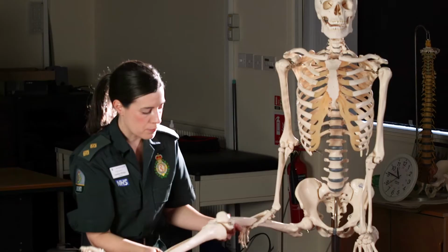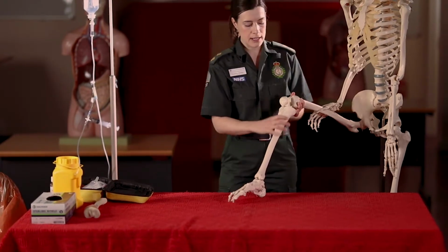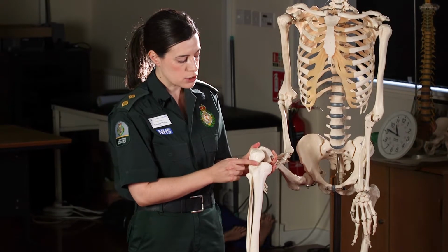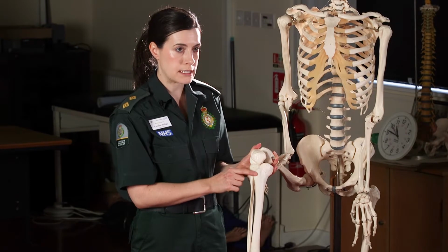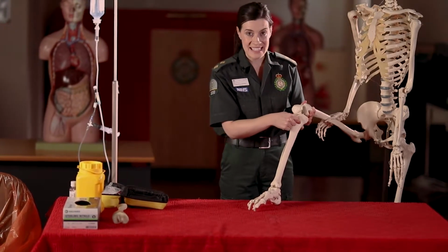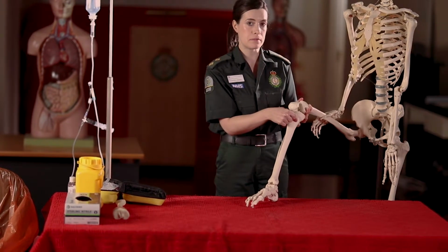Alternatively, I've got my proximal tibia site. And to locate the proximal tibia site, I find the patient's patella. I come 2 centimetres below that, where I can feel the tibial tuberosity. Coming 2 centimetres medially to this is my site for the proximal tibia.